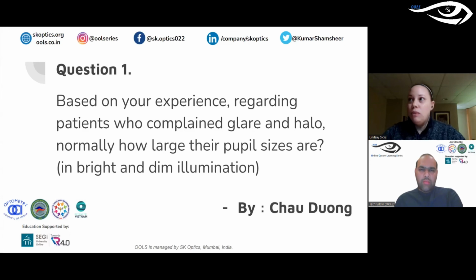We image 150 students every year, and there's always one that we can never get because they just can't get their eye into our small cone. So we can take them to the large cone design that we have. Right. Thank you so much for that suggestion.